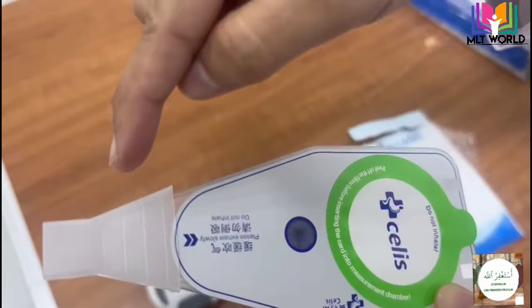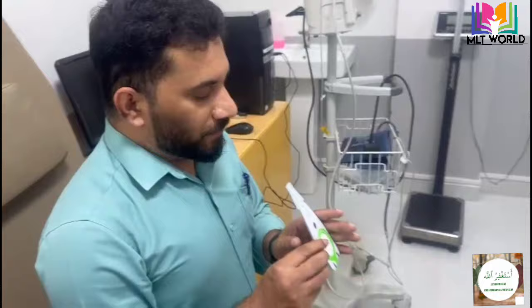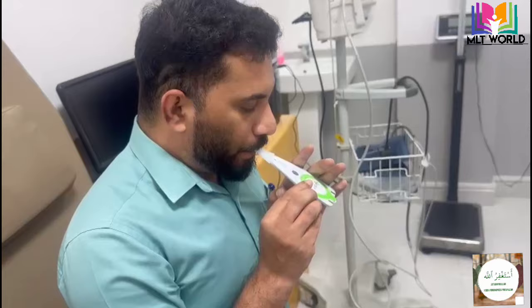You can see the blue color in the card. When the patient continuously breathes for at least 4 to 5 minutes, this color will change to white. The patient should take a deep breath and then exhale into the card, and after that bring the card down.